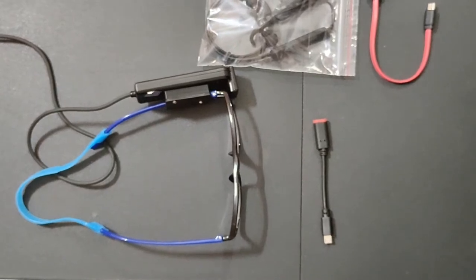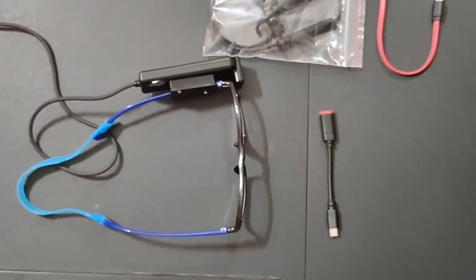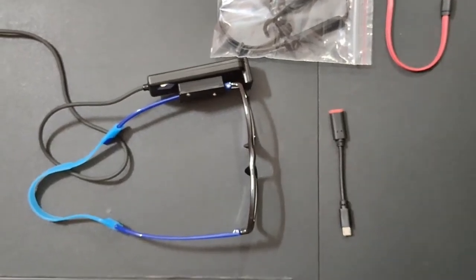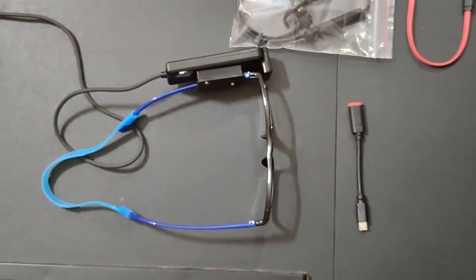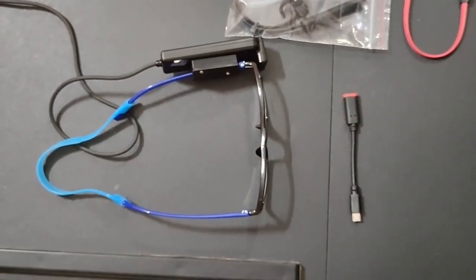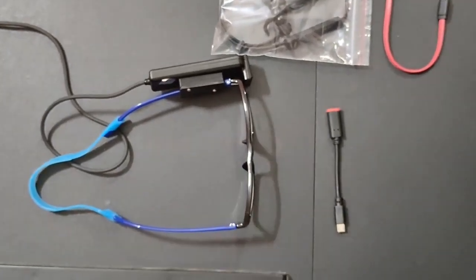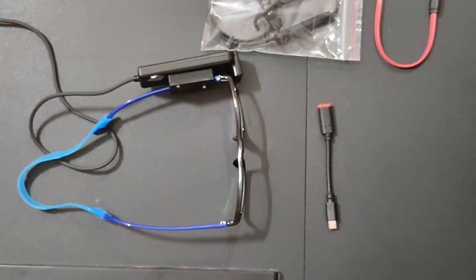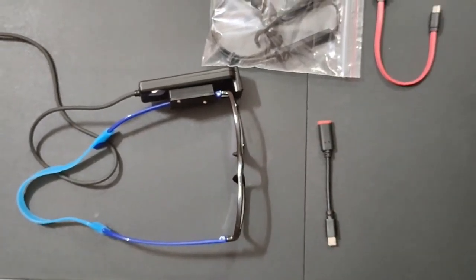I have given a trial of these smart vision glasses to almost 10 blind patients and 2 partially sighted patients, and they are all using it and very happy with this device. I want everyone to know about this device — let's join hands together so that all blind persons can benefit from it. Thank you so much.